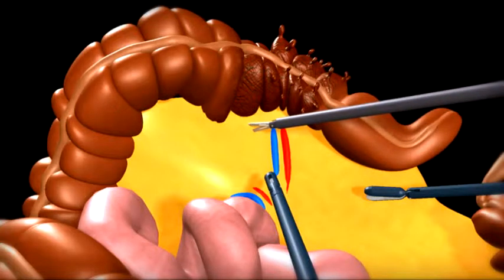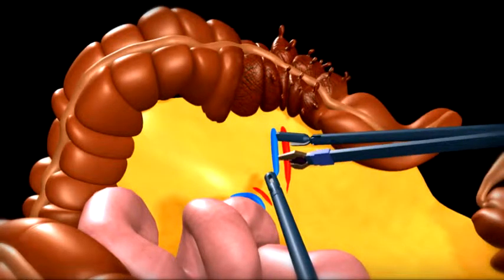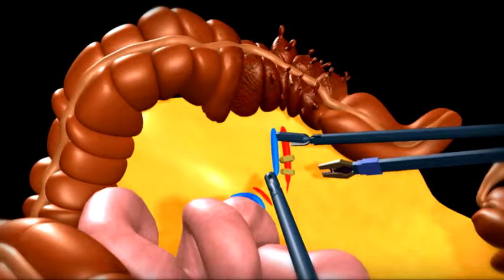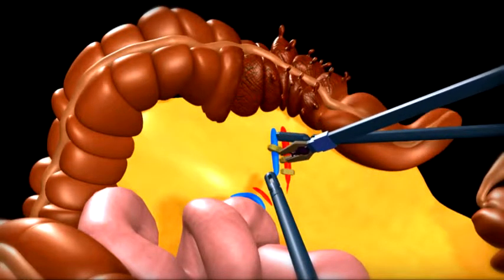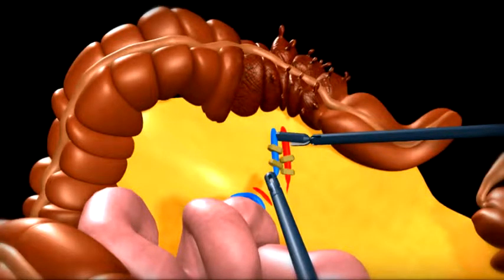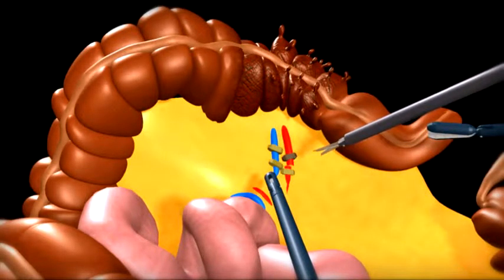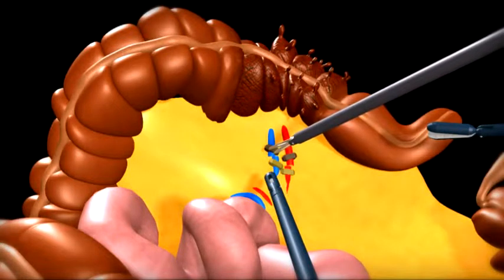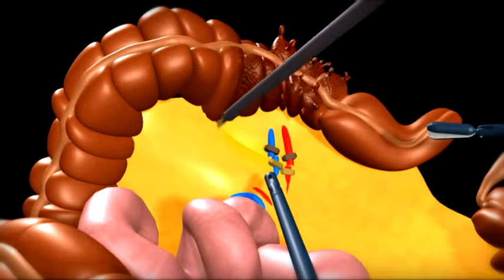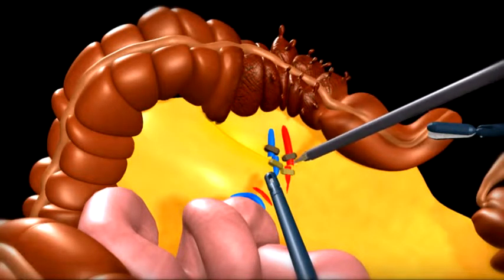The mesentery is opened to reveal the blood supply to the diseased portion of the colon. The blood supply is clipped and divided. The other attachments to the colon are divided to free the colon.